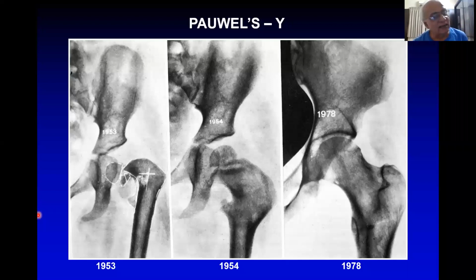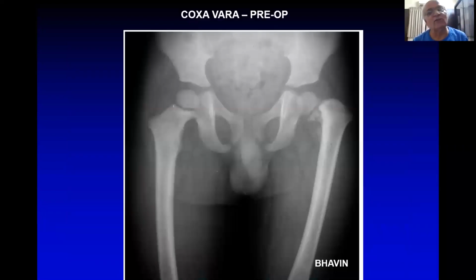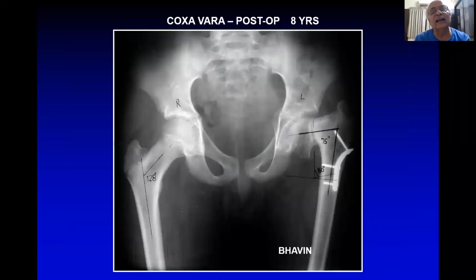This is one patient my chief operated when I was just a houseman at that time. Look at this. This is a triangular piece of Fairbanks, and this was congenital coxa vara. He did the osteotomy, but it failed, and he had the courage to do a re-osteotomy on this patient again. So this patient came after 3 or 4 years, and this coxa vara was not good.